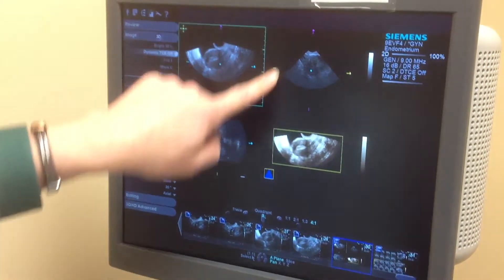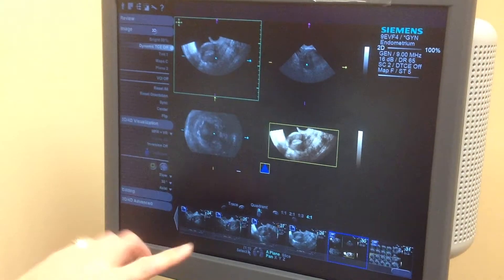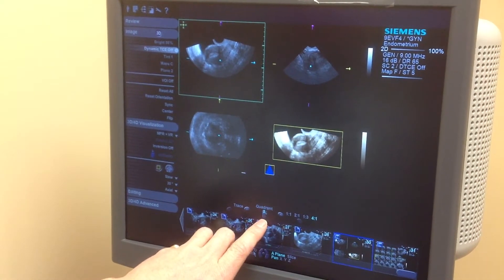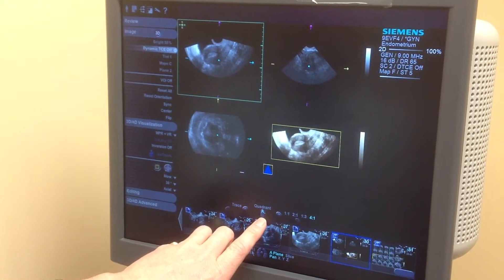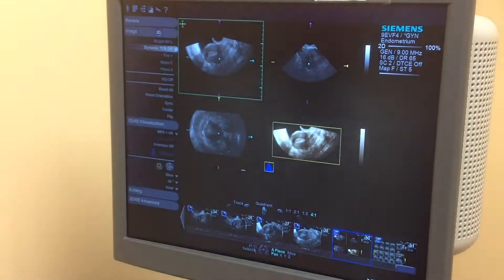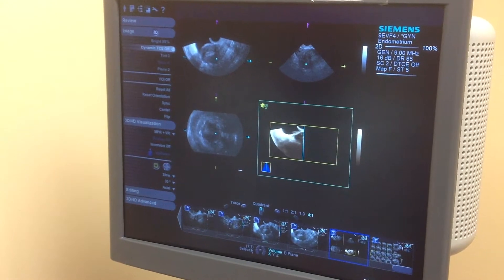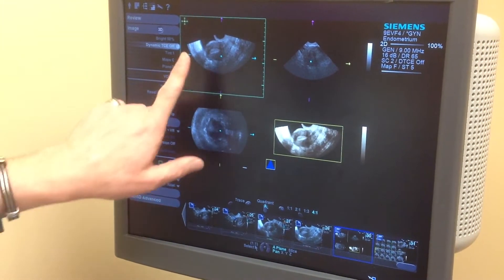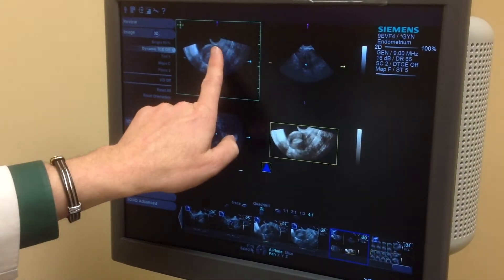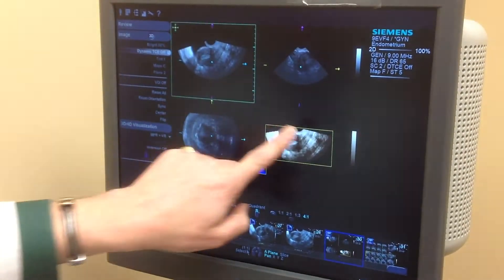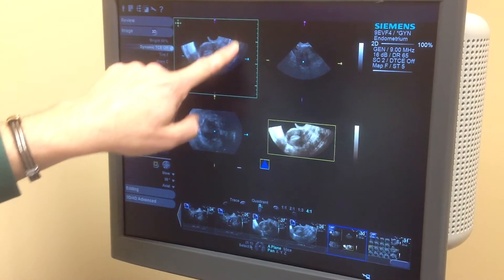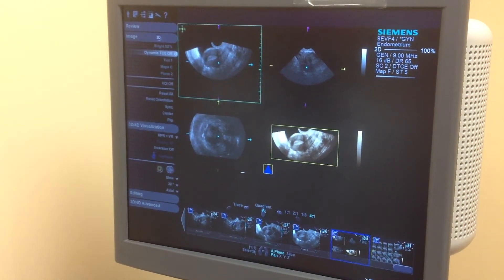Once your volume is reactivated, you're going to see the active box is green. Anytime you want to change your quadrant, use the thumb wheel — you can see me changing this and the different quadrants are changing. The first quadrant is A, then B, C, and the render. The A quadrant is your acquisition quadrant, and here's our long uterus that we acquired with the nice midline picture.